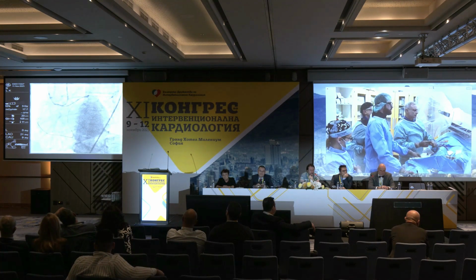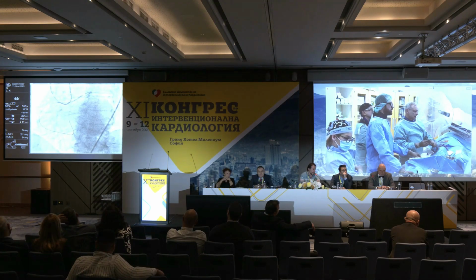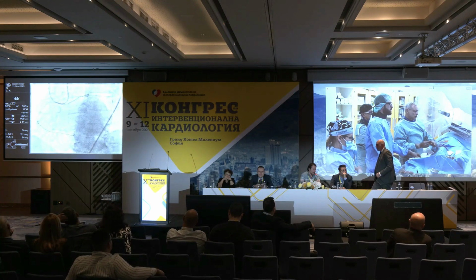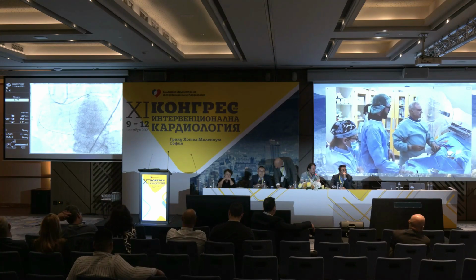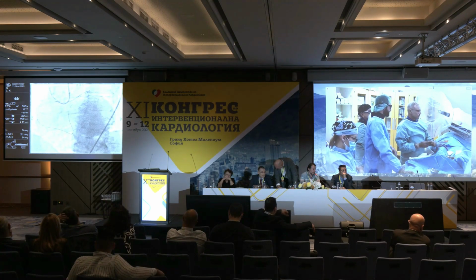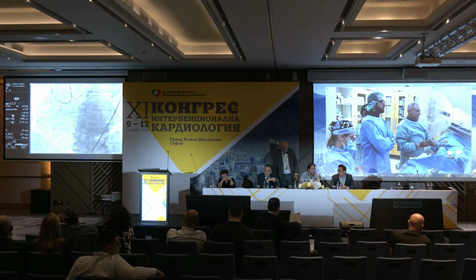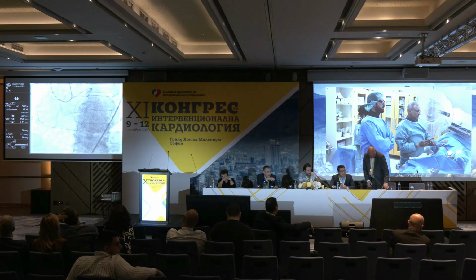You're absolutely right. But as you see, I'm exploring different pathways. If I can guide the wire, and as you said, knuckling is an option here that we have to do, and bilateral knuckling. But in order to make sure that we're not going to have any course outside the vessel, I'm trying now to find one way that I can puncture a little bit with more resistance. The wire is going up. That means that there are a lot of branches, but it's going strangely. You see in many different directions.